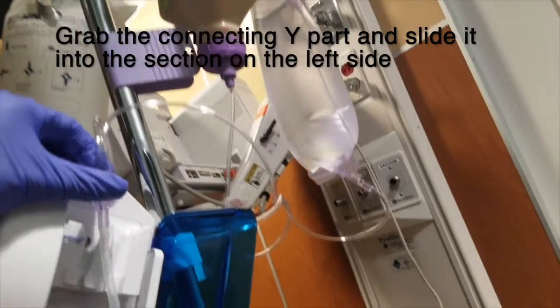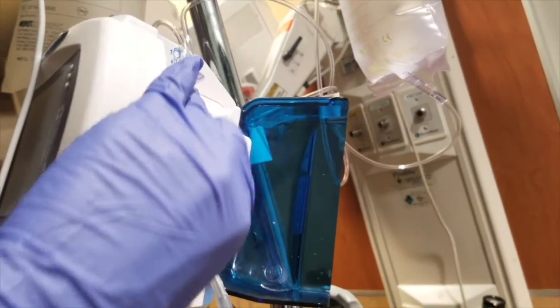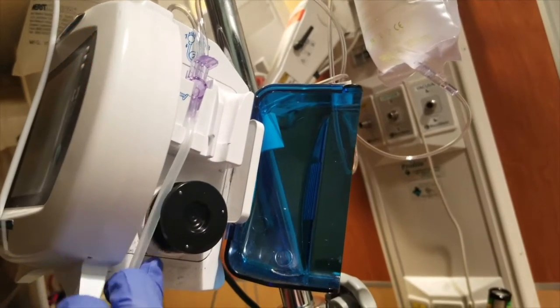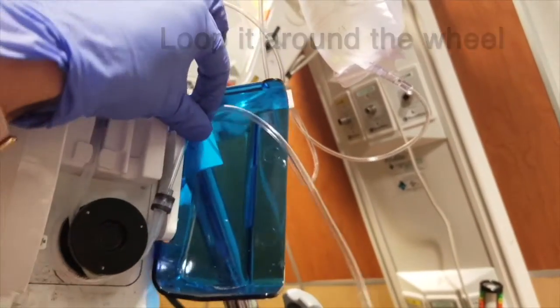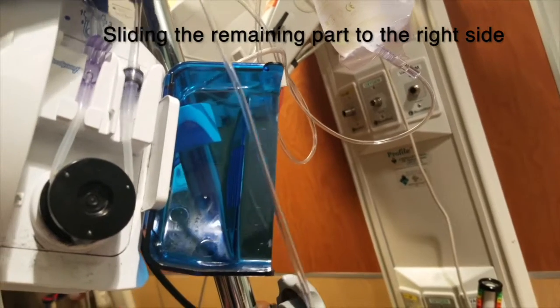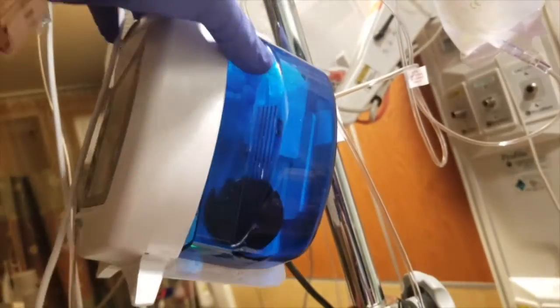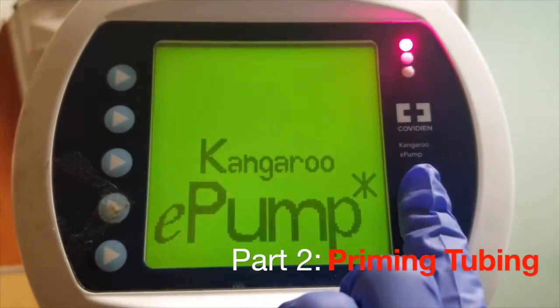Grab the connecting Y part and slide it into the section on the left side. Loop it around the wheel and slide the remaining tubing to the right side. In case you forget, there is a little diagram provided on the pump to instruct you on how to do it. Close the handle, pushing it until you hear a click. Press the power to turn on the pump.